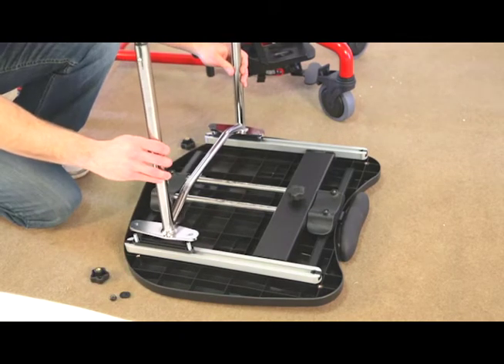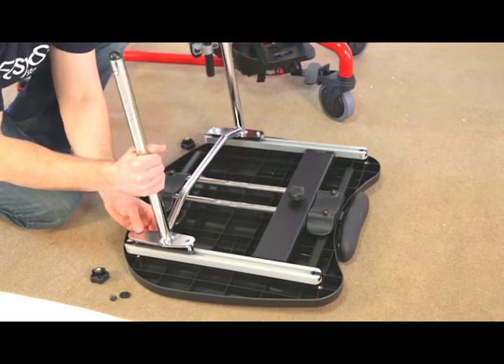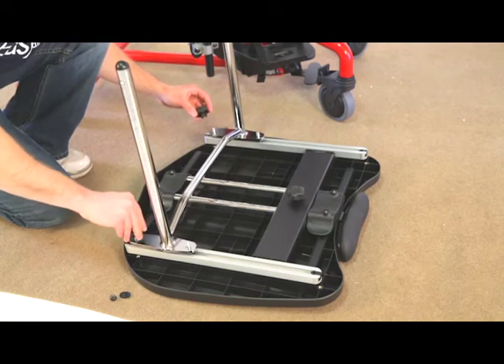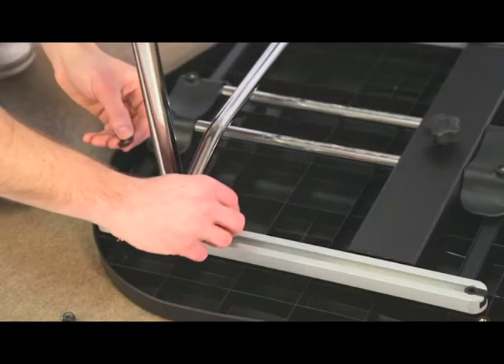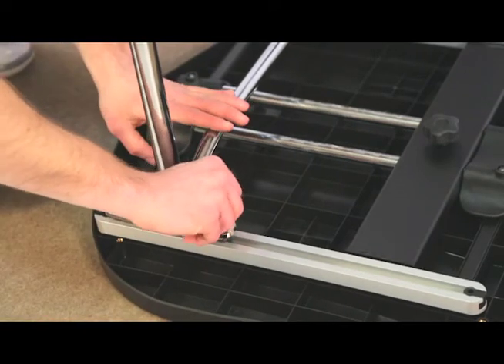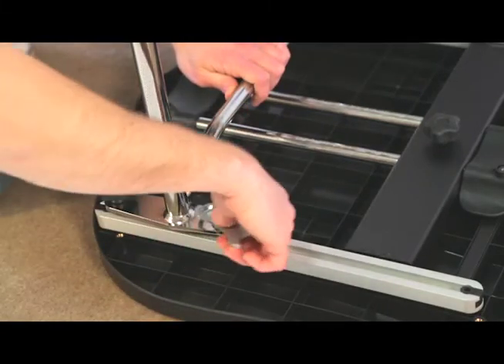Place the tray bracket onto the bolts with the shorter ends of the bracket facing the chest pad. Place the knobs onto each bolt and tighten snug. Place the 2 washers onto each bolt, then place the nut onto each bolt and tighten until you expose a thread. The washers should still be able to spin freely.